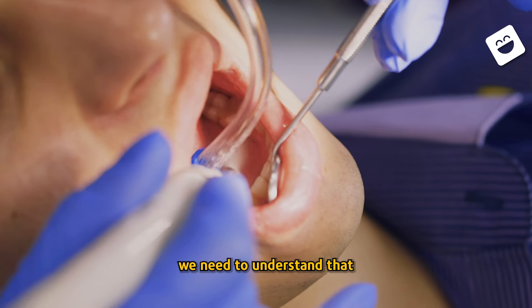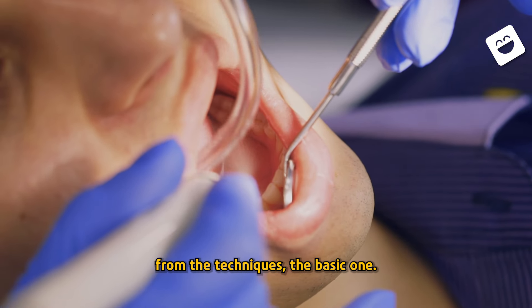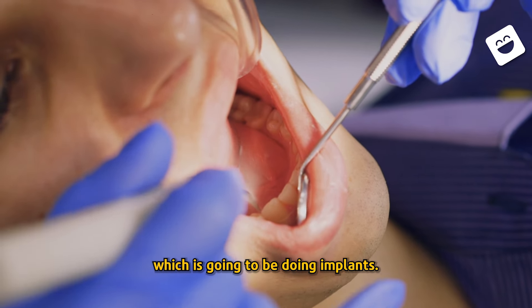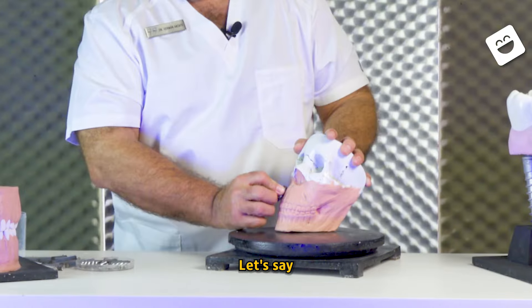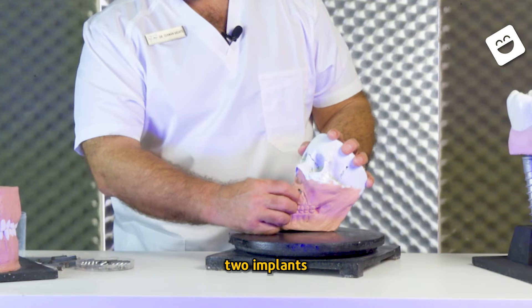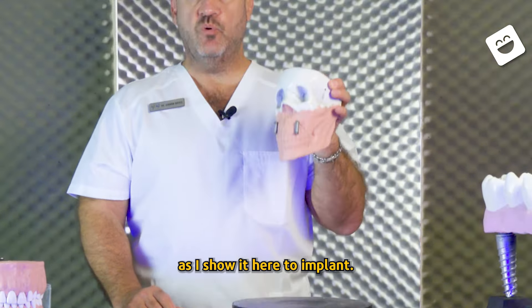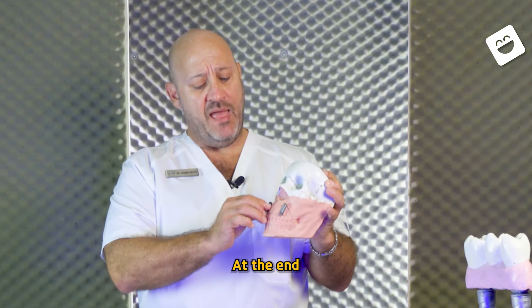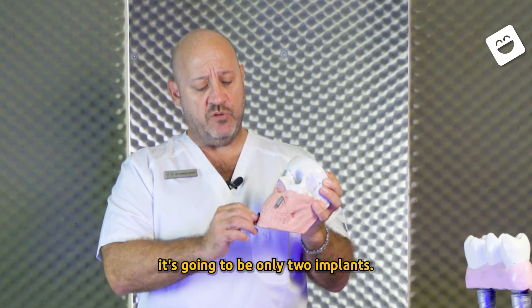With this, we need to understand that from the techniques, the basic one is to go for the most simple technique, which is going to be two implants. Let's say that you perform two implants, as I show it here. It could be an upper maxilla or it could be a mandible. At the end, it's going to be only two implants.